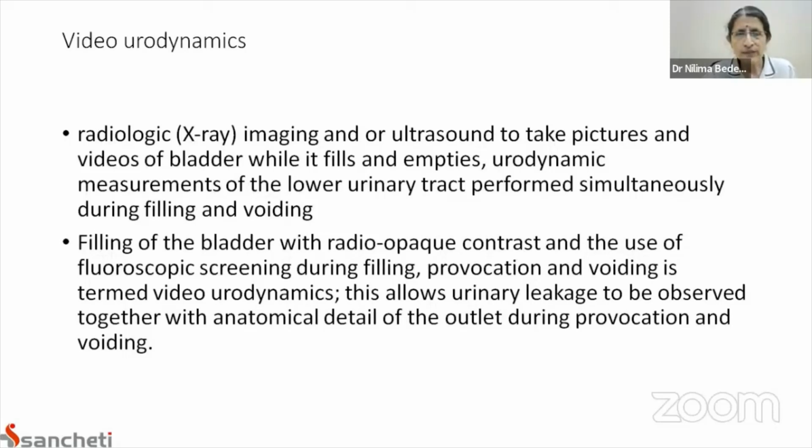This filling of the bladder with radio-opaque contrast and use of fluoroscopic screening during filling, provocation and voiding is termed video urodynamics. This allows urinary leakage to be observed together with anatomical details of the outlet during provocation and voiding.